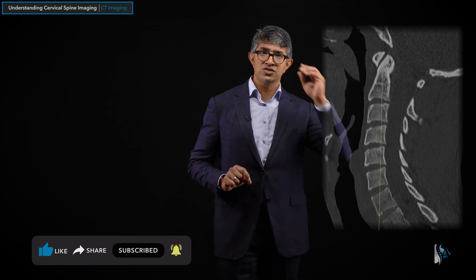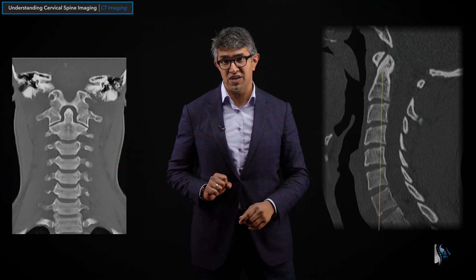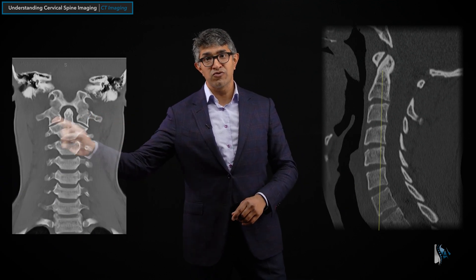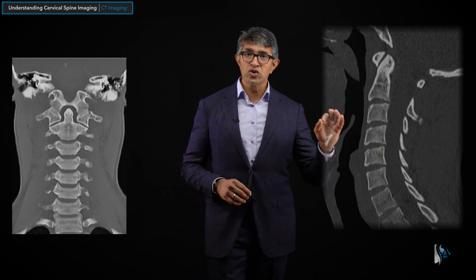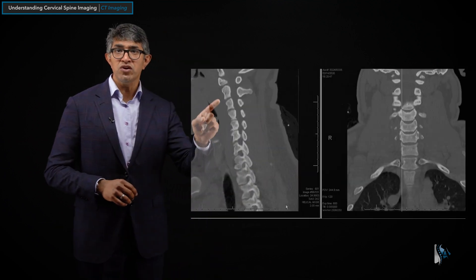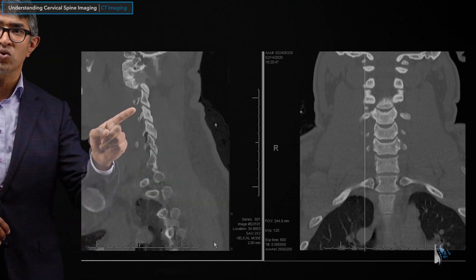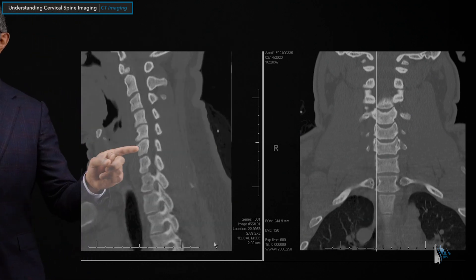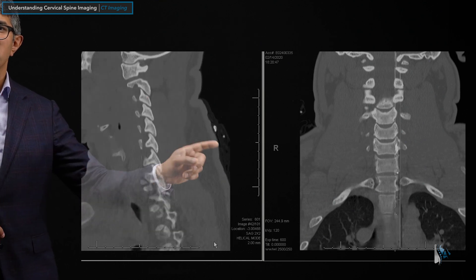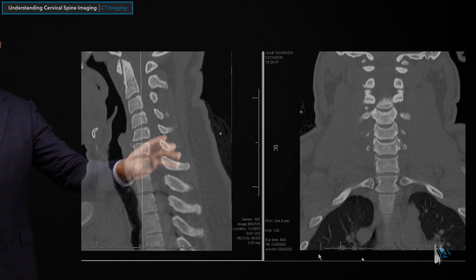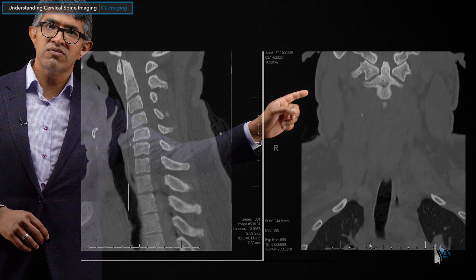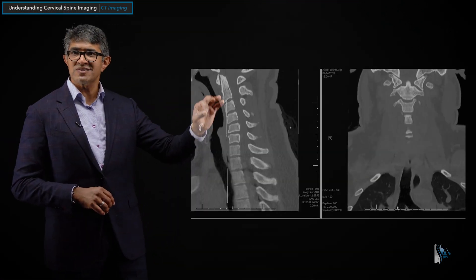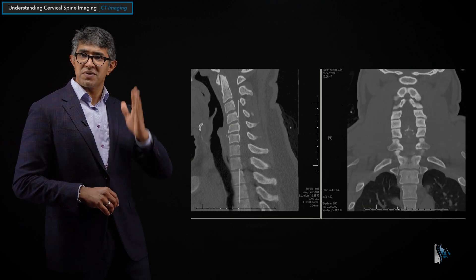You can also take a coronal slice through a CT scan, and these are almost always available — not always available for an MRI, but most of the time available for a CAT scan. This gives you a picture showing left and right symmetry. And if you work your way through it as a series of slices, you can see the sagittal sequences marching from right to left — the joints, the lateral masses, the vertebral bodies, the spinal canal. Similarly, you can get the same with the coronal sequences — sliding through to see the vertebral bodies in the front and lateral masses on the sides. Really understanding the bony anatomy by stacking up all of these slices is most of the time how your surgeon will look at these images.